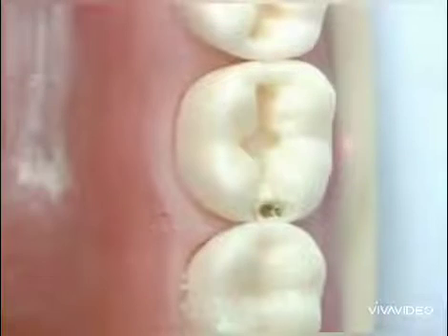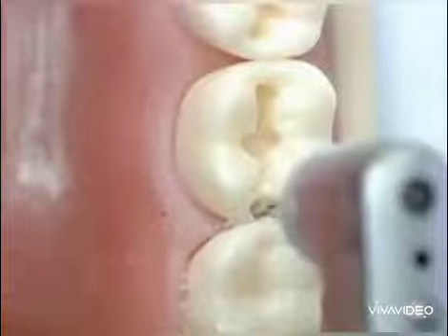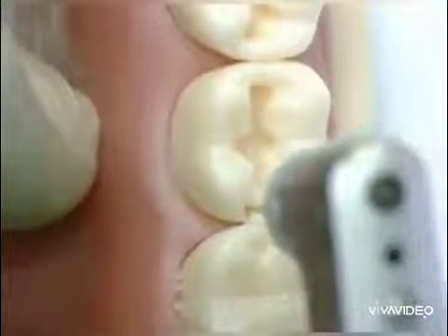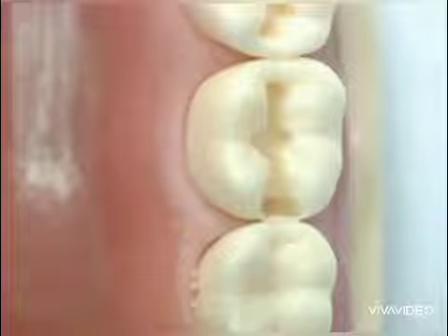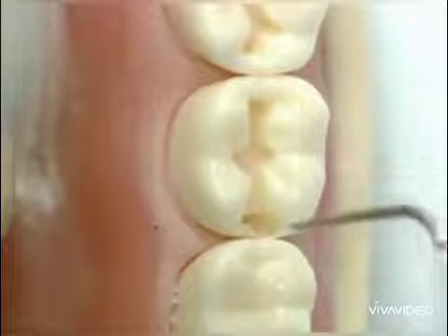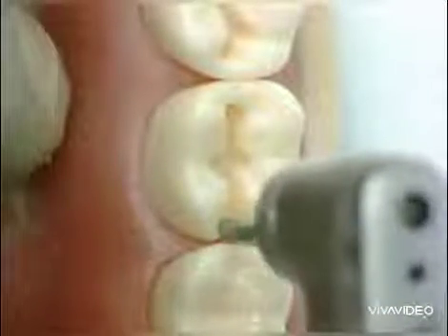Continue the removal of the remaining thin shell of tooth structure. The buccal wall of the proximal box should converge occlusally and diverge proximally. The lingual wall of the proximal box should also converge occlusally and diverge proximally. Any remnants are removed with a probe.